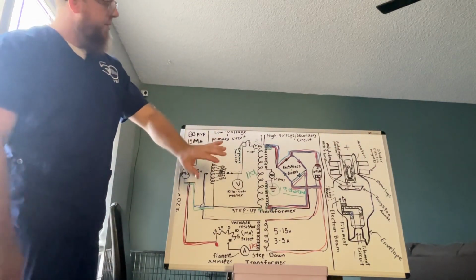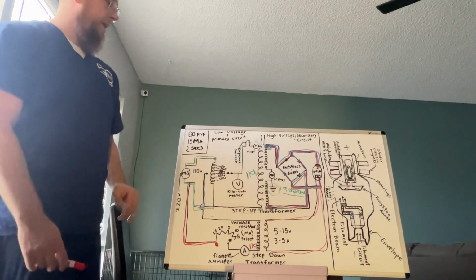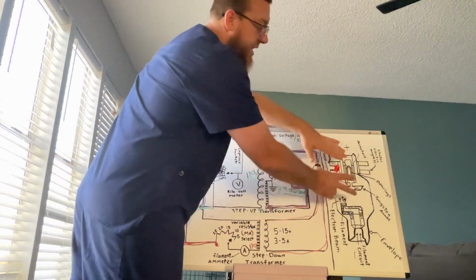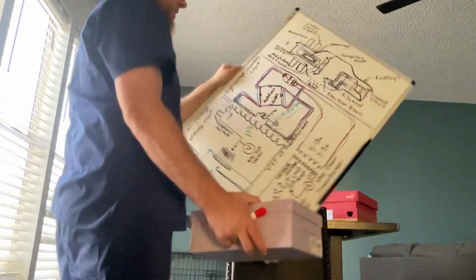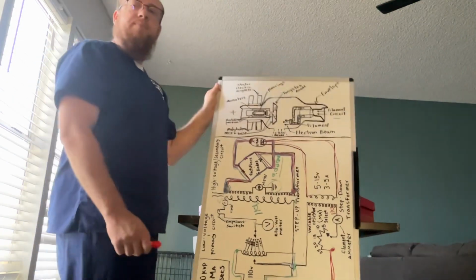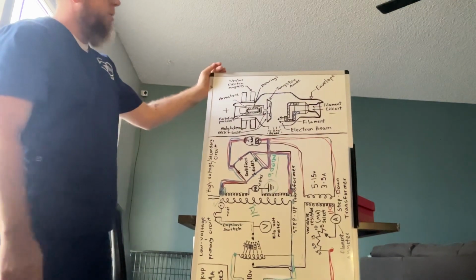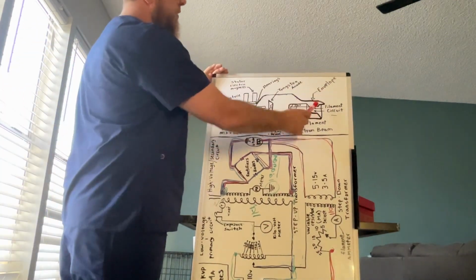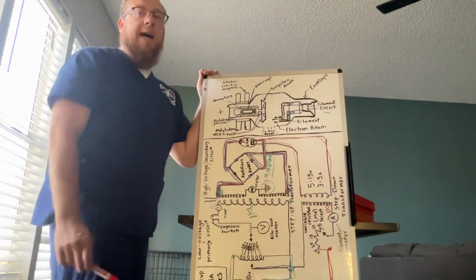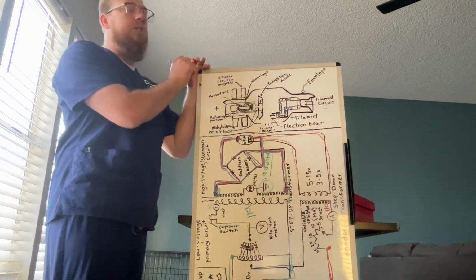So now that I've completed the circuit for the X-ray circuit, I am now going to explain the X-ray tube. All this is happening before what's happening in the tube. Once we get to the tube that you see here, this is my X-ray tube that I drew, and these are the components. We have our envelope, which is what it's made out of, and this is typically made out of Pyrex glass or metal. Metal is probably better because there's less damage to metal.